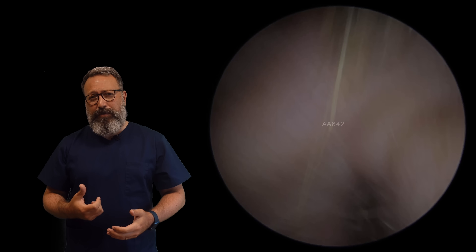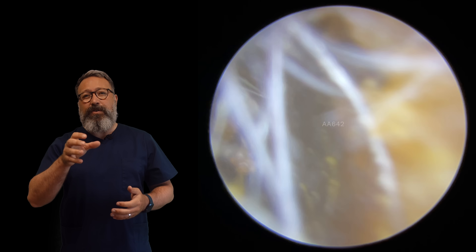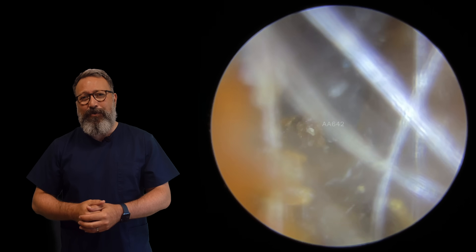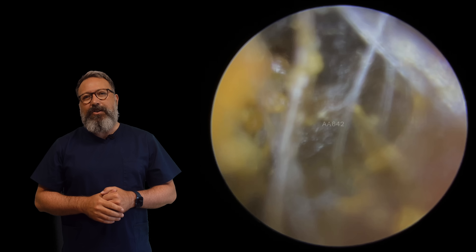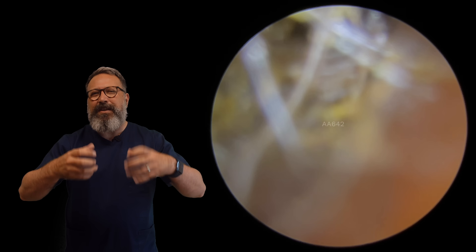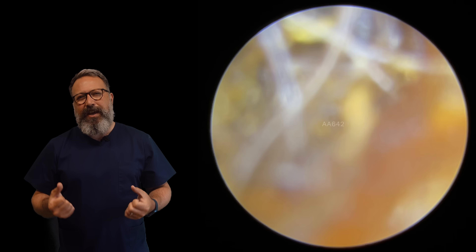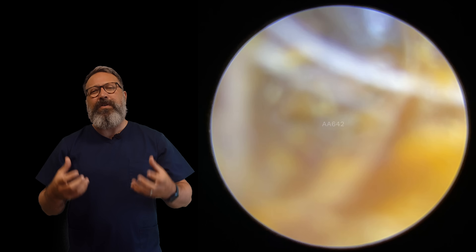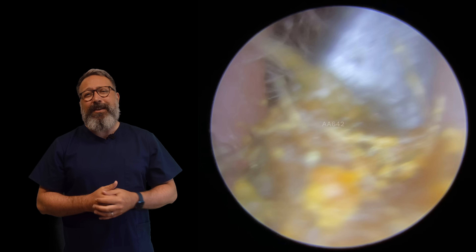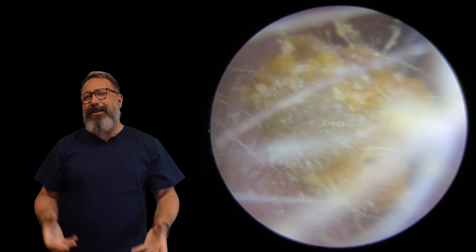All those things working together are forming a really, really difficult plug to remove. We're not even bothering with the suction — we're going straight in with the Jobson horn. You can see it's just coated around the outside edge. The reason this wax is as hard as it is: this patient suffers a lot with dry skin, and the inner part of the ear canal is really dry, not producing as much oil as it normally should, so the wax has become absolutely solid.